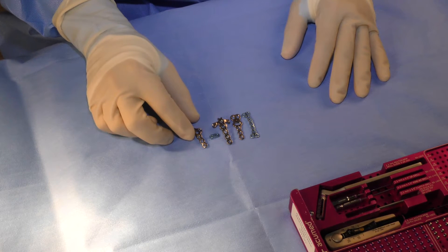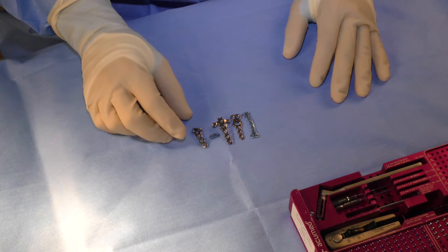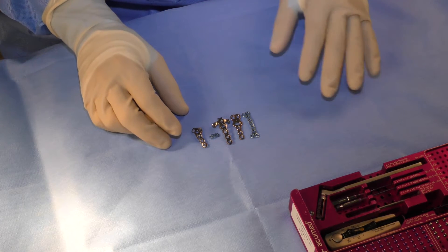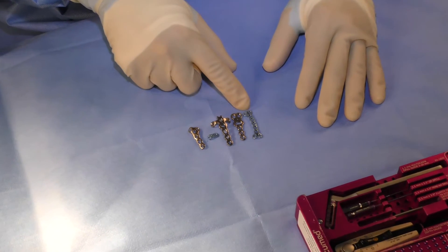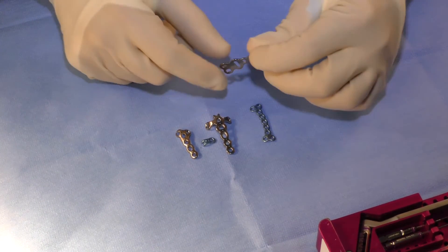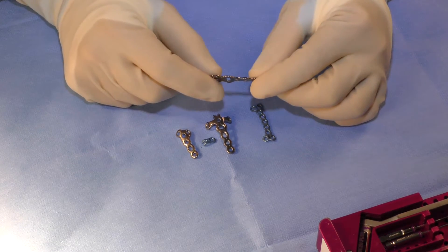Besides the usual inventory of T plates, straight plates, and compression plates, we have specific plates in the system designed for particular fracture types. As you can see, the plates come in two colors: the blue plates are the 0.8 millimeter thick plates, and the more robust thicker plates used generally for metacarpals are the 1.3 millimeter plates.